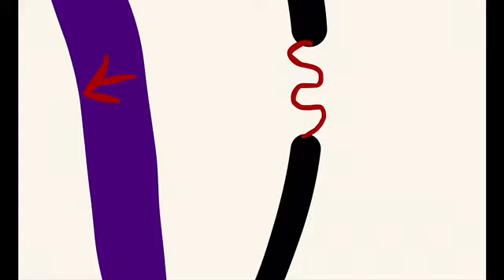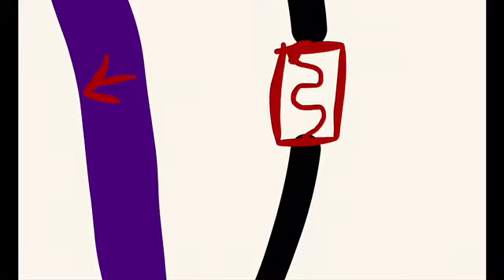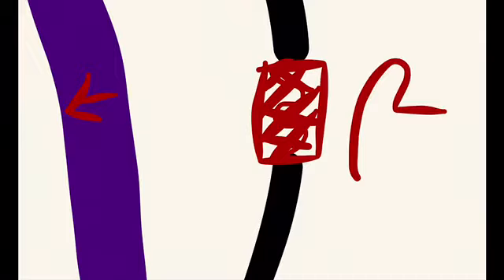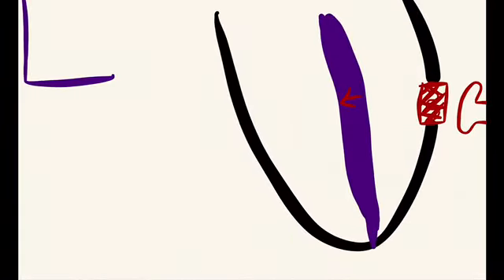Because it is dead, suppose it is completely dead, and because of this there is no conduction in this part of the heart. Okay, there is no conduction in this part of the heart. Now our lead is looking towards this side of the heart. Okay, now guys, this will create an electrically neutral window here.